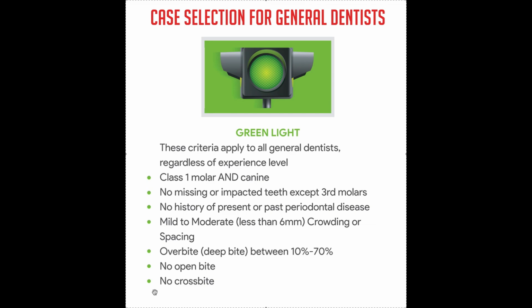So these are your green light cases. Go for it. You can do these yourself. You can probably do these with any aligner brand out there or braces. Should be super easy. There shouldn't be any complications, assuming that you treatment plan it properly. All right, so do these cases.